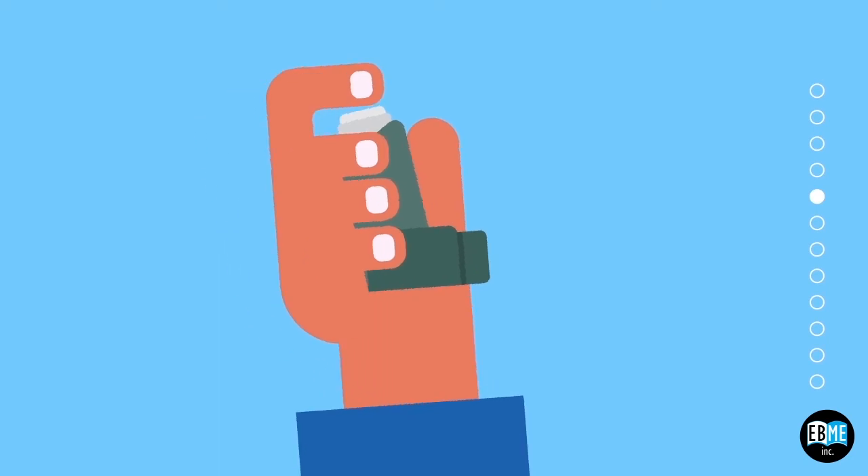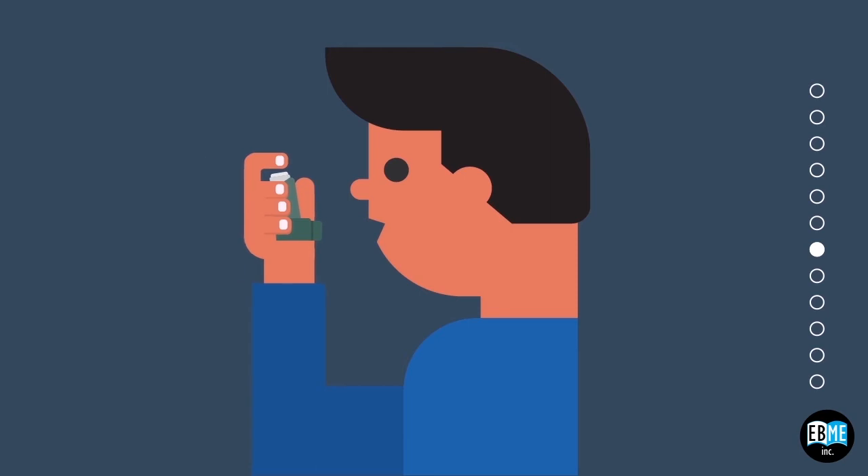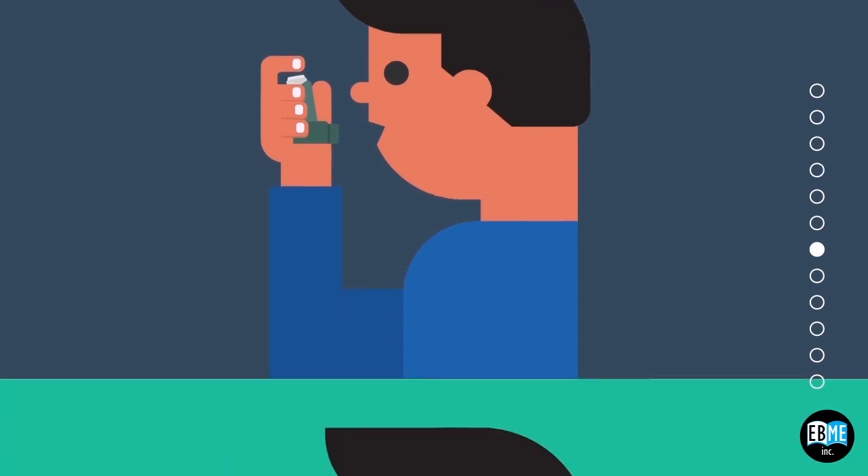Shake your MDI for 5 seconds to mix your medication in the pressurized canister. Turn your head away and exhale slowly and completely, remaining comfortable. Hold your MDI two fingers away from your mouth. This distance will help your medicine from hitting the back of your throat.